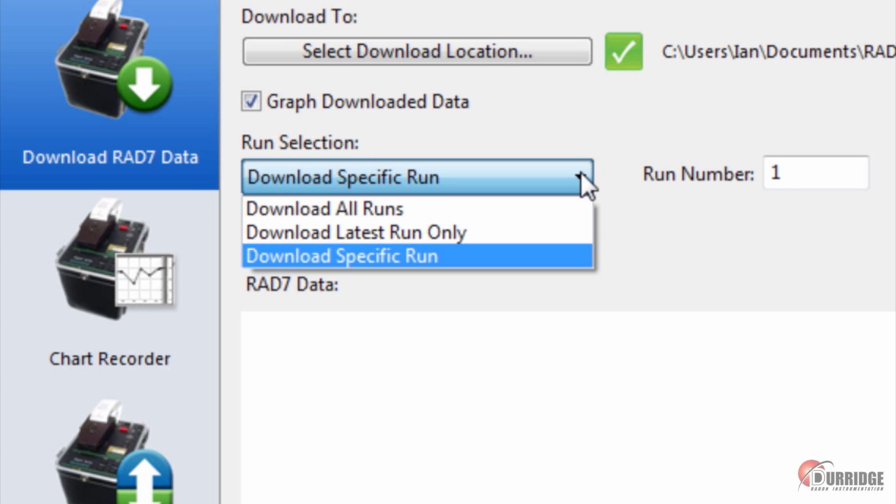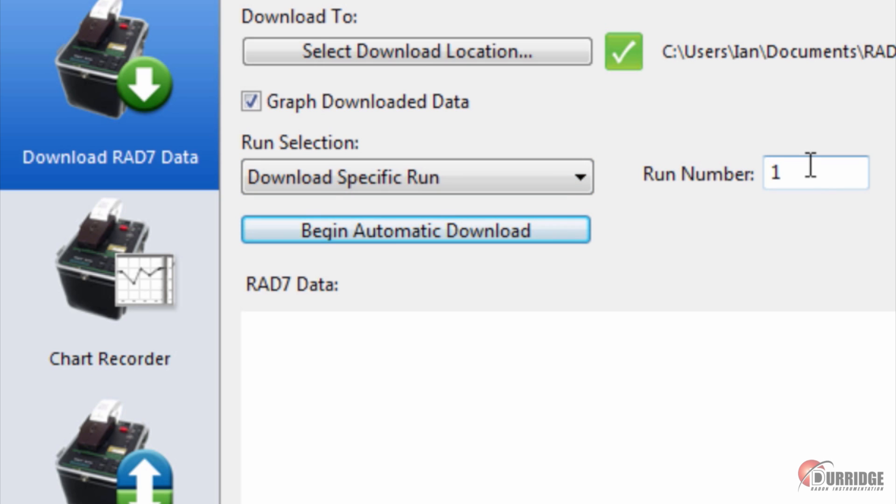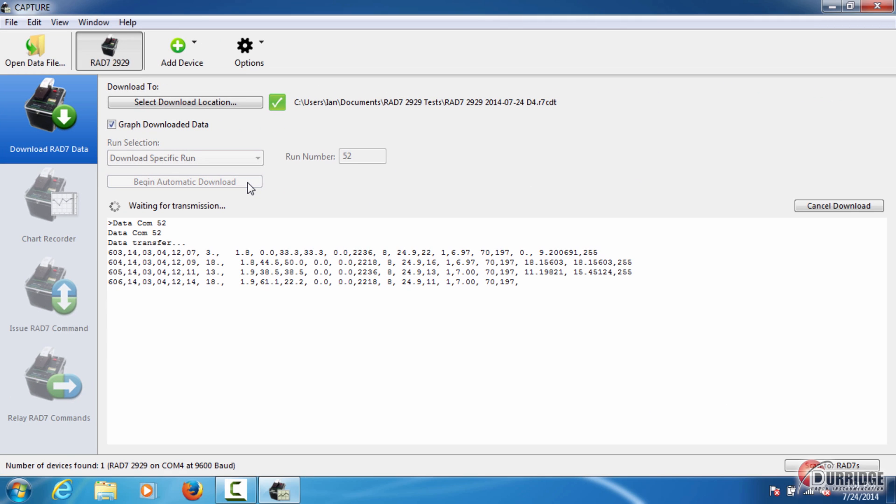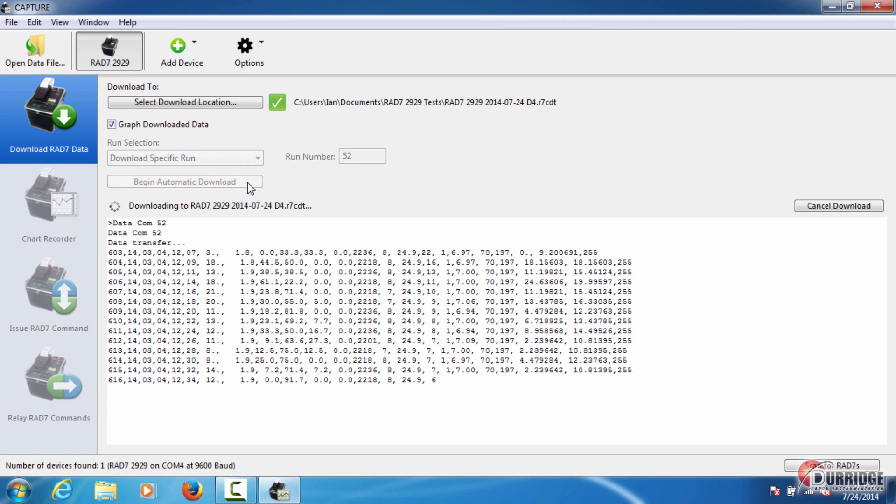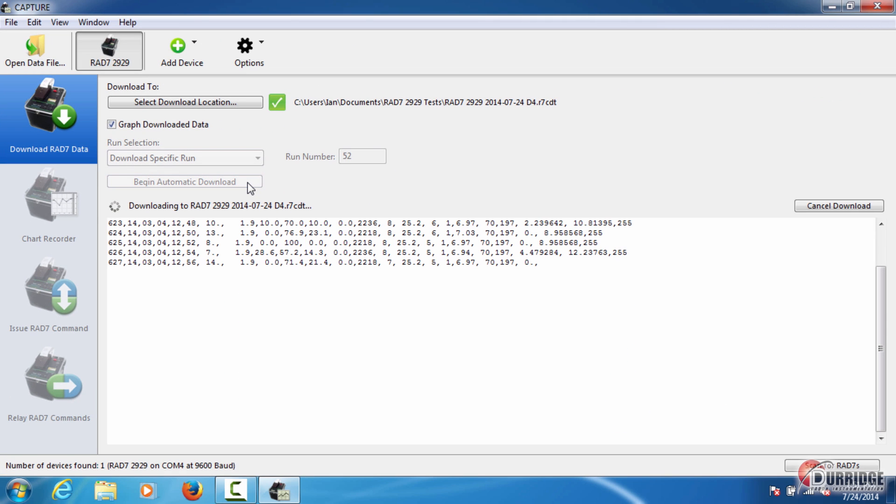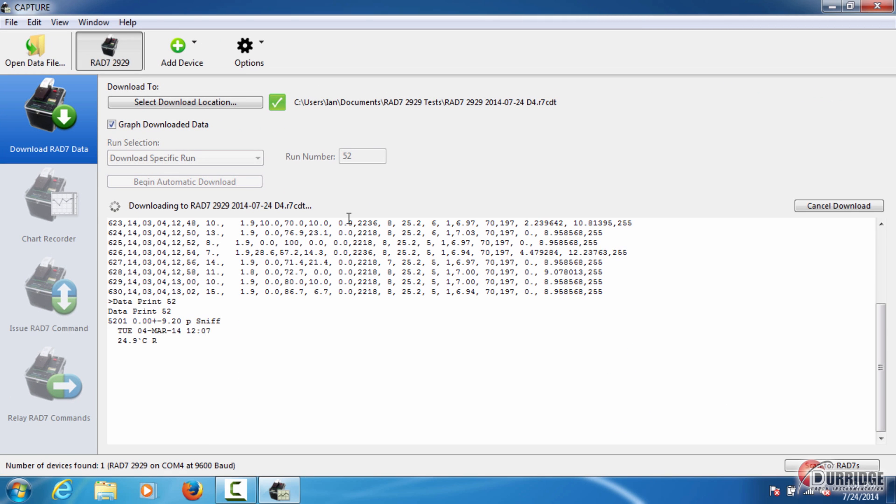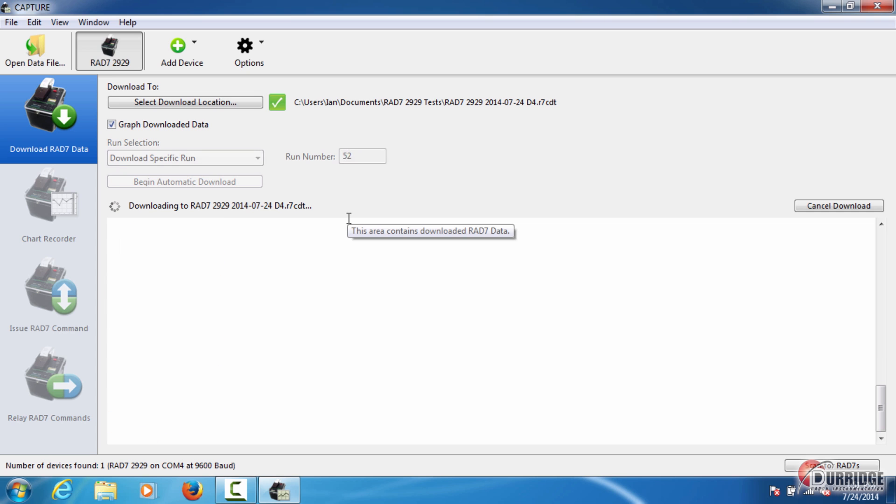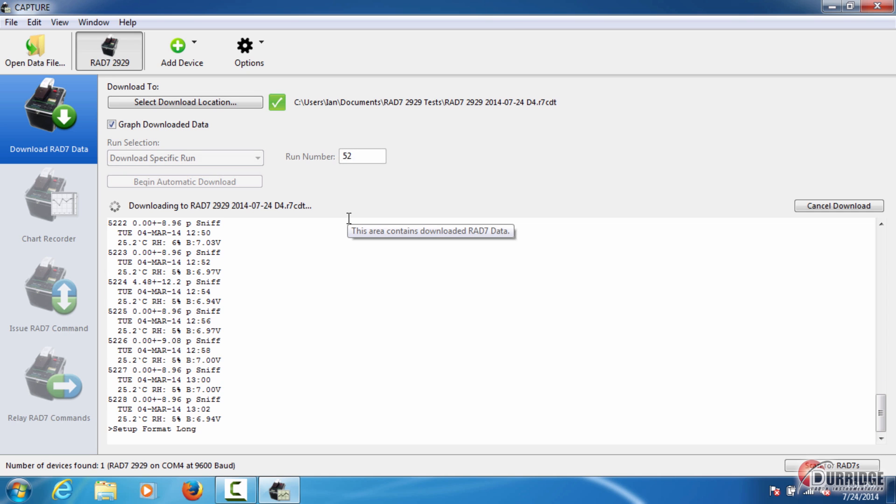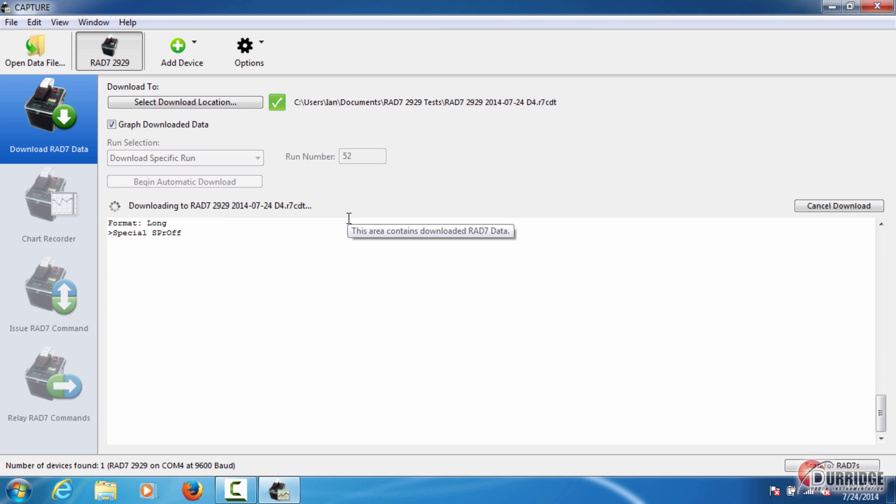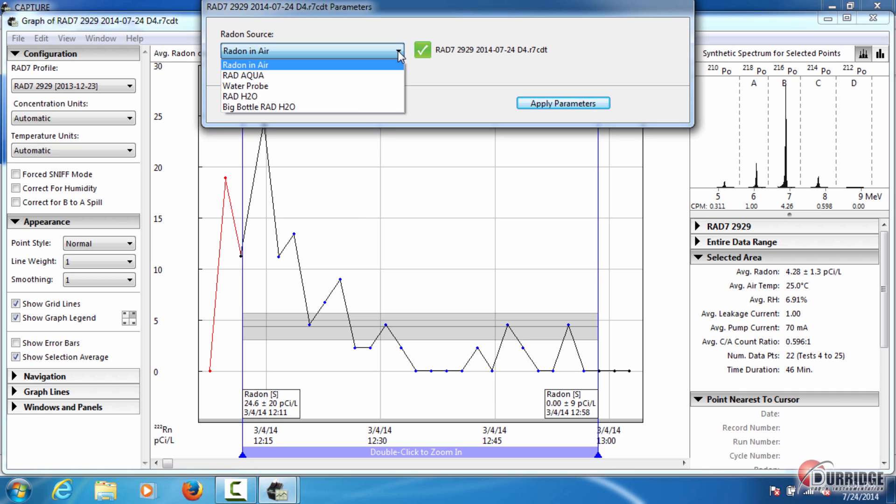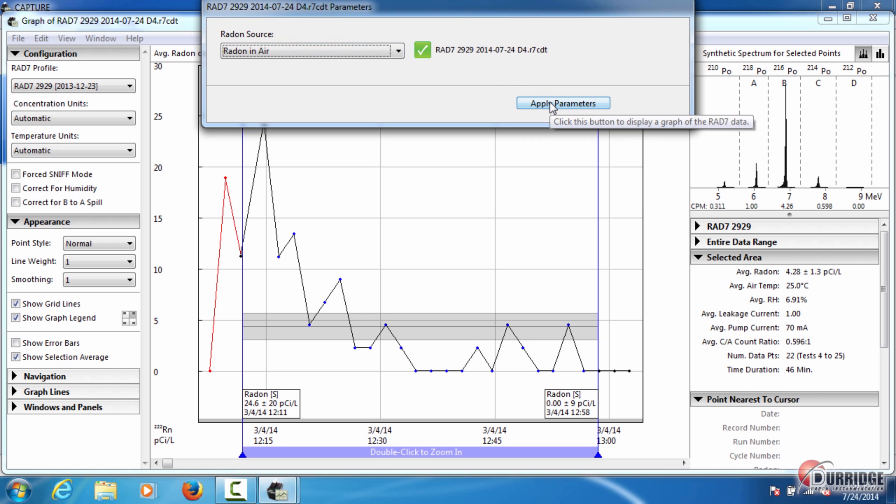Choose to download either all the test data on the RAD7, the latest test, or a specific run number. Then click Begin Automatic Download. See the data upload in the RAD7 data box. When the upload is complete, the graph window and the Radon Source prompt window will appear. In the Radon Source window, select the type of test that you ran in the RAD7. For any test done in Air, leave the selection as Radon in Air. Then click Apply Parameters.